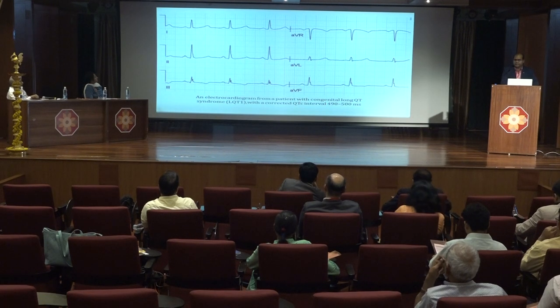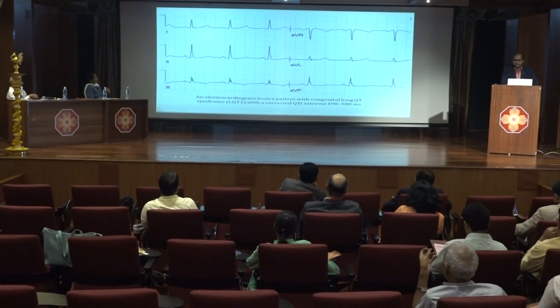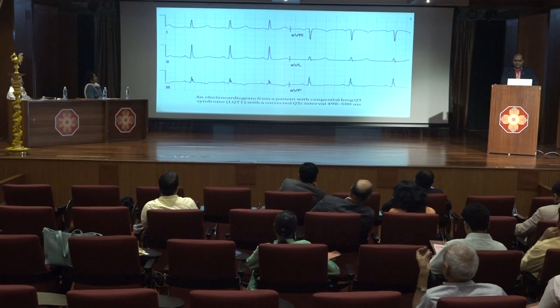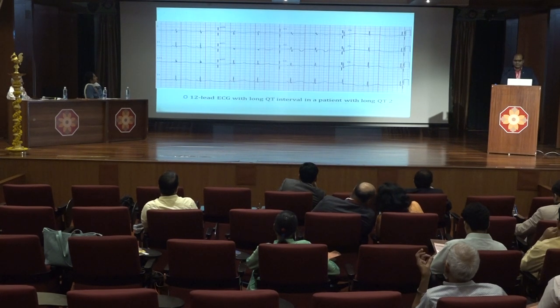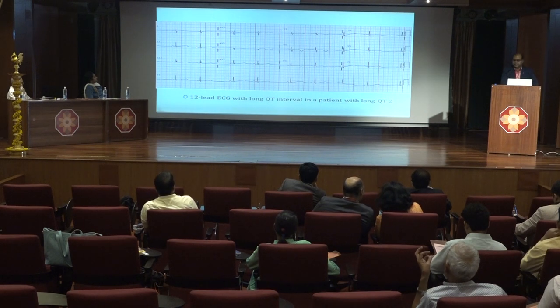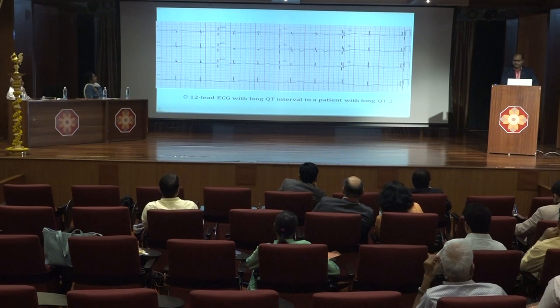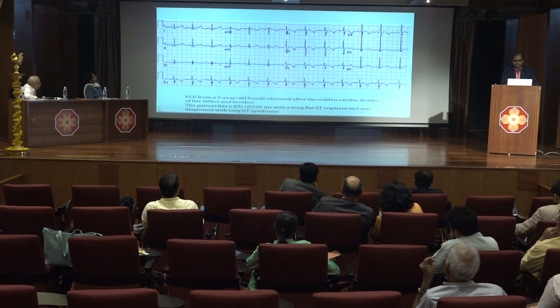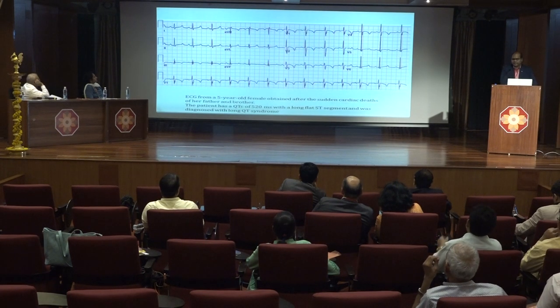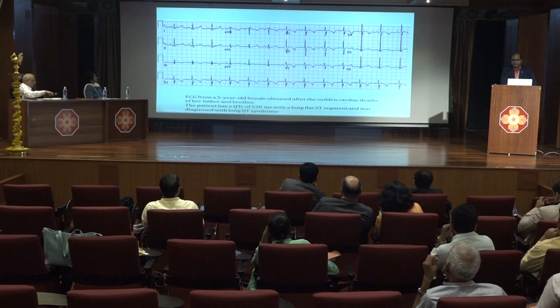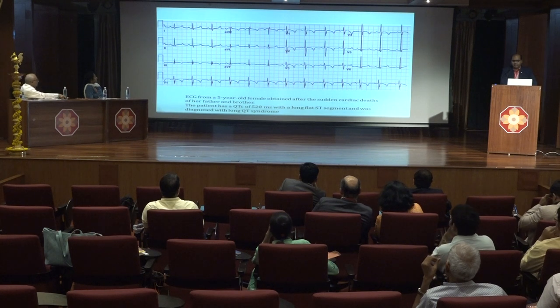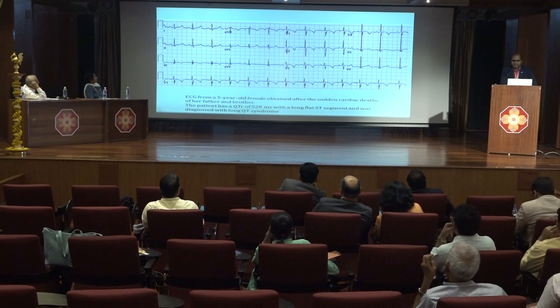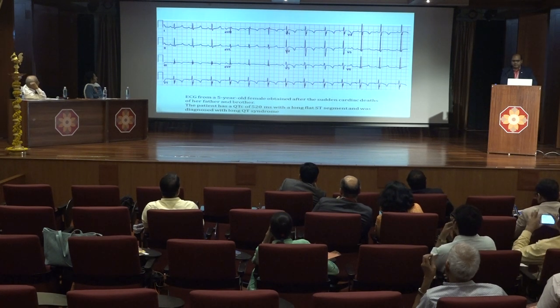This ECG from a typical LQT1 patient shows a prolonged QT interval with a broad-based T wave. The second ECG from an LQT2 patient shows a bifid T wave and long QT interval in lead II. A third ECG from a 5-year-old child obtained during family screening for sudden cardiac death shows a long isoelectric segment followed by a narrow-based T wave, consistent with LQT3.